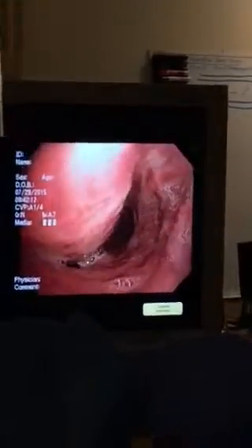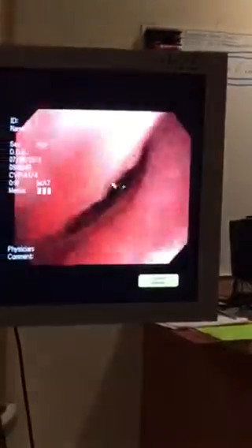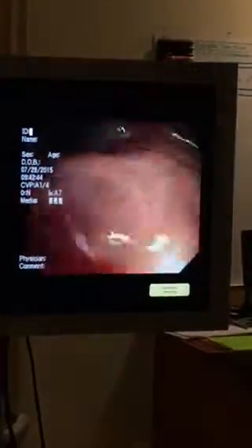Ideally, when you put all that lidocaine on the cords, it keeps them from having that kind of spasm, but you can paralyze it very quickly. Okay, lidocaine on the left. You see the degree of secretions we had down here. It shouldn't be like that either. It's just copious secretions. So what I'm going to do initially is just clear out these airways.